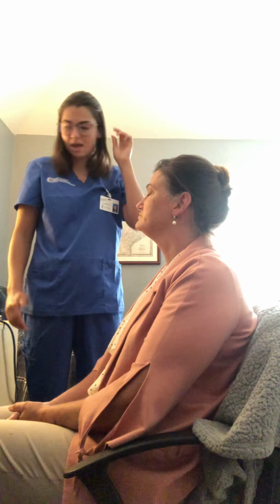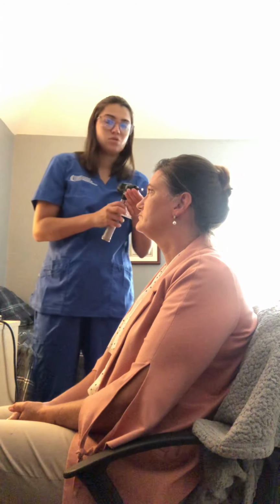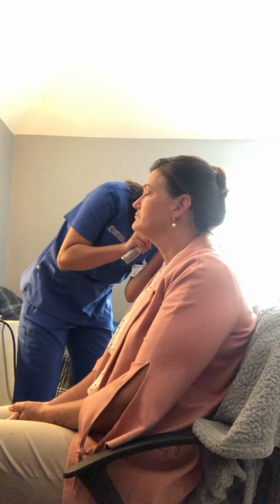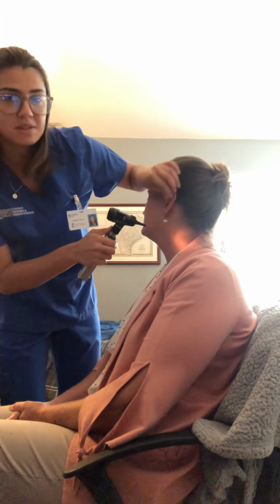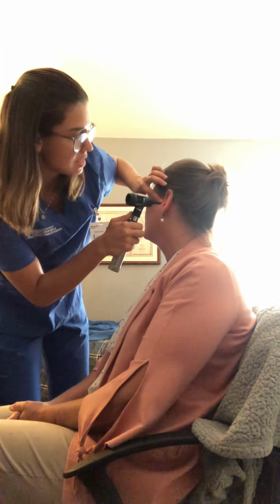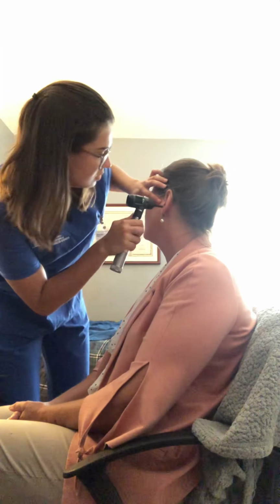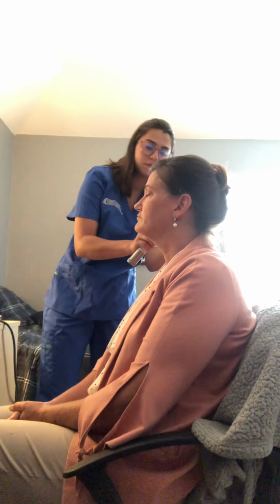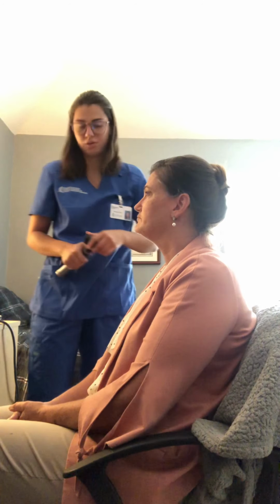Next, I will go ahead and use the light here to examine the external auditory canal for cerumen, which is earwax. A moderate amount of earwax is normal. However, I will be looking for any excessive amounts of earwax or drainage that might be present. So both ears are clear and no abnormal amount of earwax is present, so everything looks good.